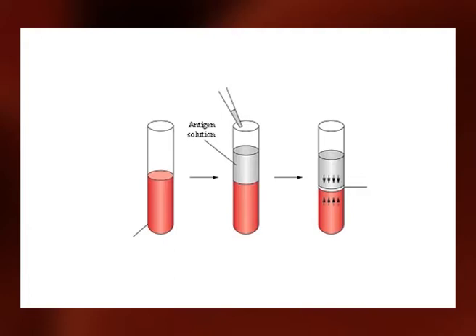This indicates that the sample is of human origin. No precipitate is formed if a blood stain extract is from a non-human origin. In a positive reaction, a white precipitate between the two layers observed after several minutes indicates that a sample is of human origin. If the blood stain extract is not human, no precipitation should occur.